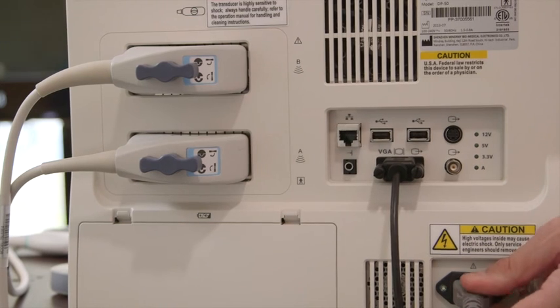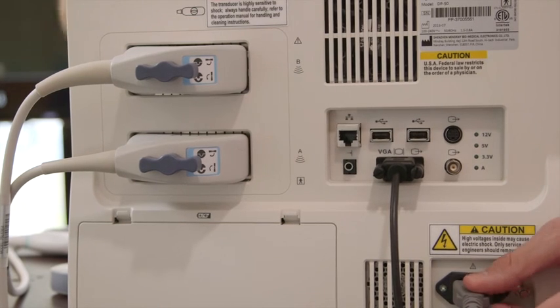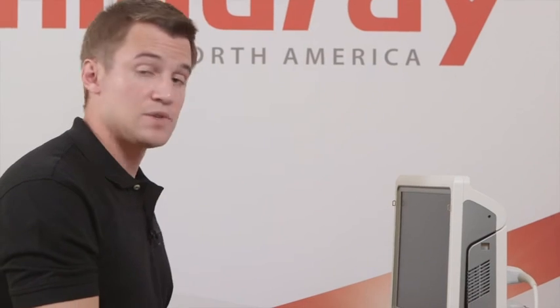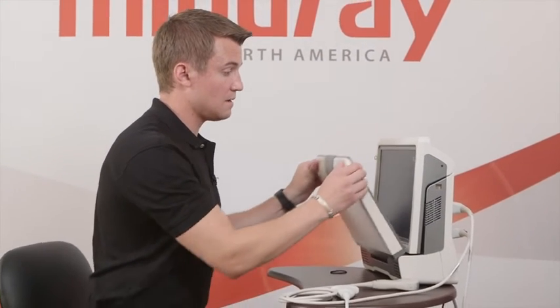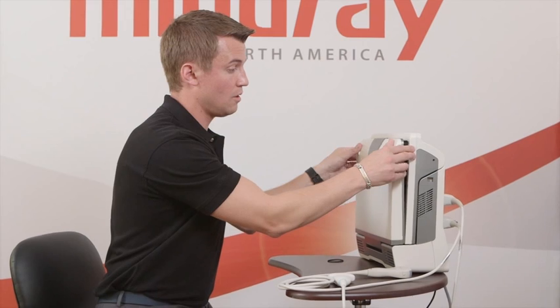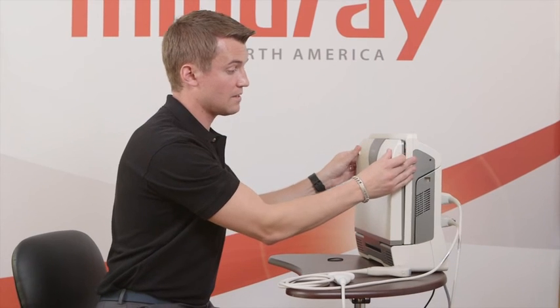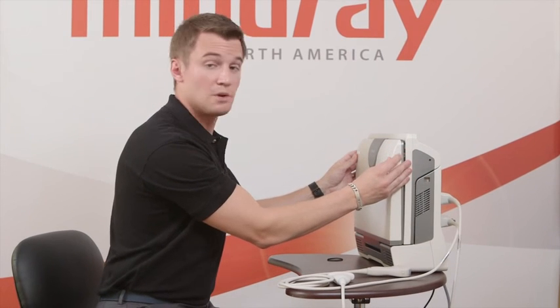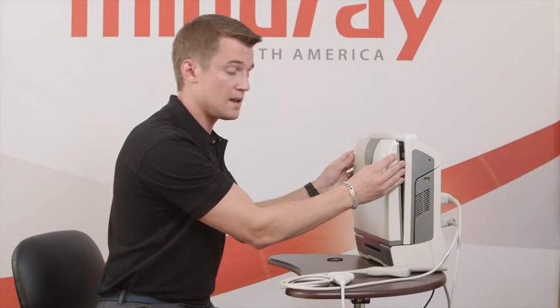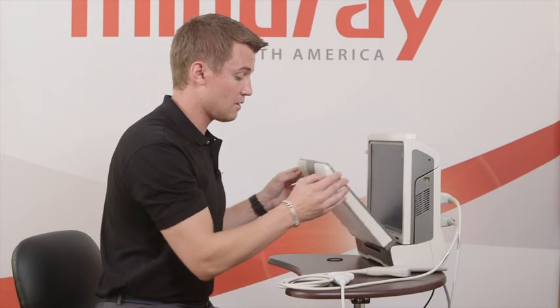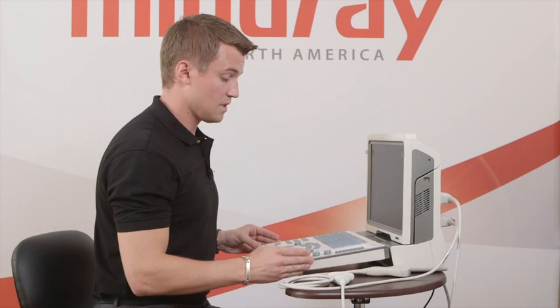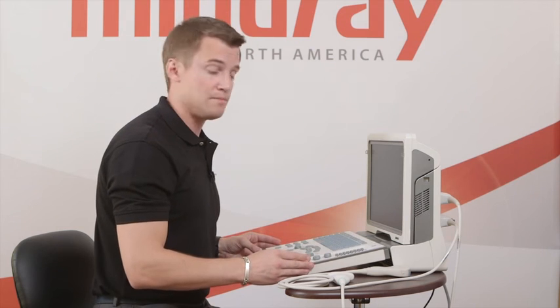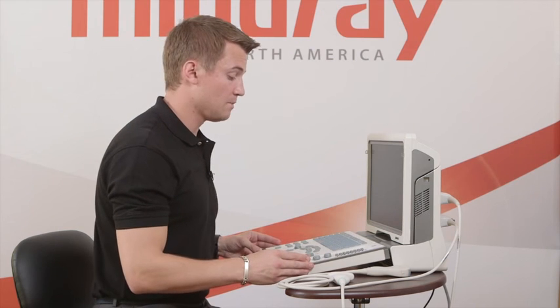If you do have the cart, you'll see that the DP-50 fits right into place on the UMT-150, and you'll notice that when you have the machine, it'll arrive looking like this. Use the two little buttons on the side to bring down where the keyboard is in the control panel.